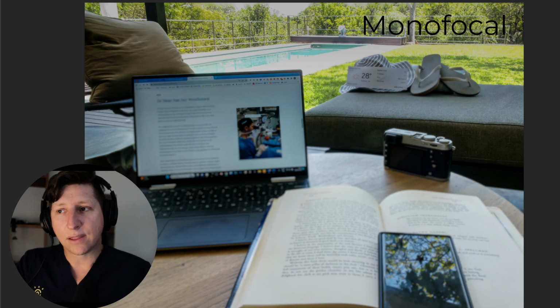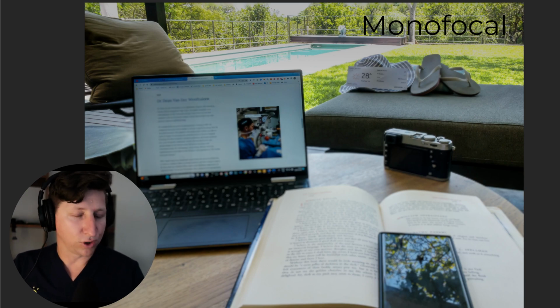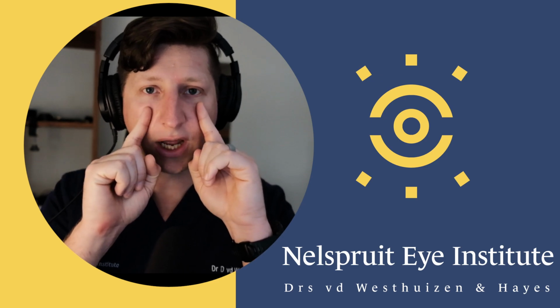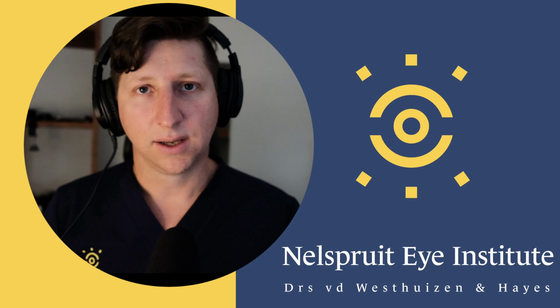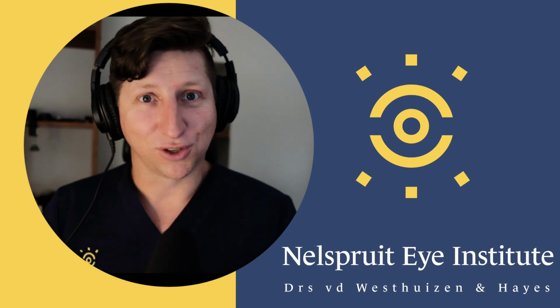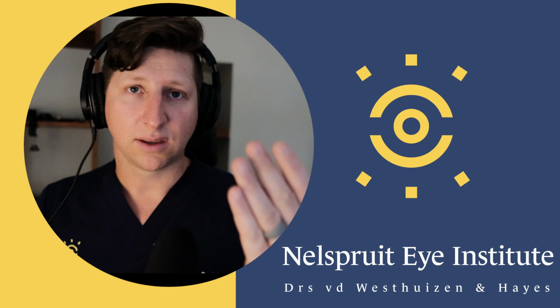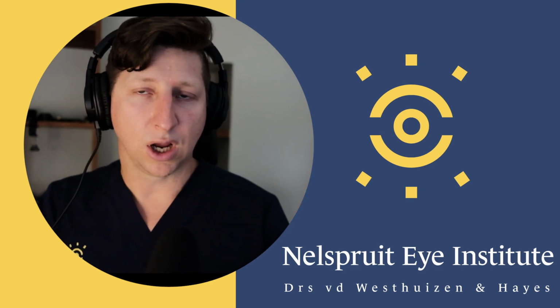The other option that one can do with a monofocal lens is something called monovision. So monovision is essentially doing something different for each eye. So for one eye, the dominant eye, let's say the right eye, the eye that you would normally shoot with, you would set that for distance. So your distance vision is good in that eye. And in the other eye, the non-dominant eye, you would set that focus nearer. So one is able to see nearer with that eye.